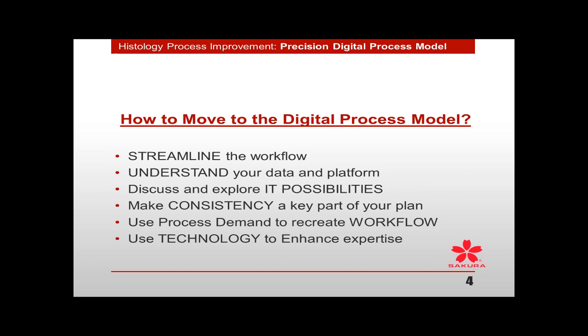You can't replace your glass completely with digital. You have to understand your data and your platforms, understand not only the software of your digital scanner, but how that software is going to work with your LIS systems, whether you have a different system for your anatomic pathology and then your information system.